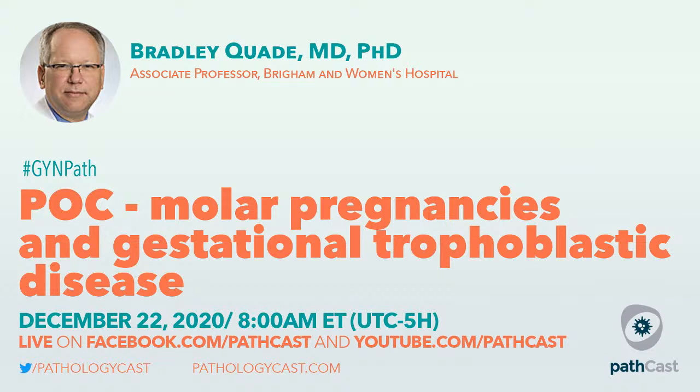It's really the combination of these two, sort of infarcty villus thrombosis plus chronic intervillositis pattern. So I think that's going to be the distinctive look. It's a chronic intervillositis with acute inflammatory cells and trophoblastic necrosis.